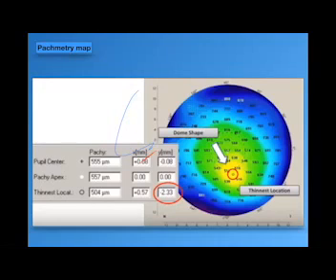So study here the thickness. The thinnest location in the cornea should be more than 490 to think of refractive surgery.